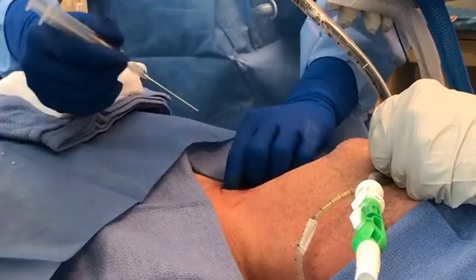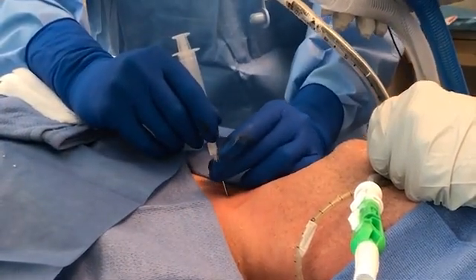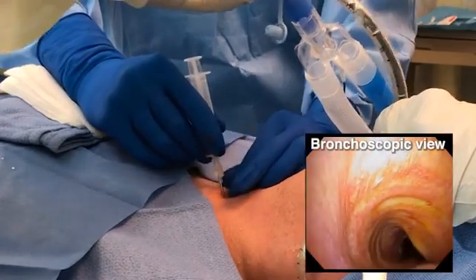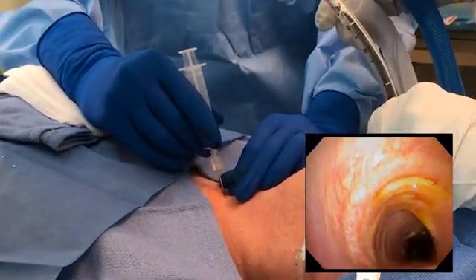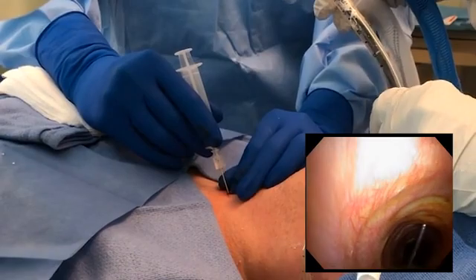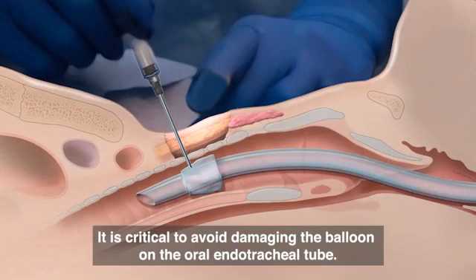Once the oral endotracheal tube has been withdrawn to an appropriate location, perform the tracheostomy using the Seldinger technique. Insert the introducer needle through the anterior wall of the trachea under direct bronchoscopic visualization. The needle should be inserted at approximately the level of the second tracheal ring, perpendicular to the trachea, with the bevel facing down. Placement of the needle bevel in this downward position will help to direct the guide wire into the distal trachea. It is critical to avoid damaging the balloon on the oral endotracheal tube.